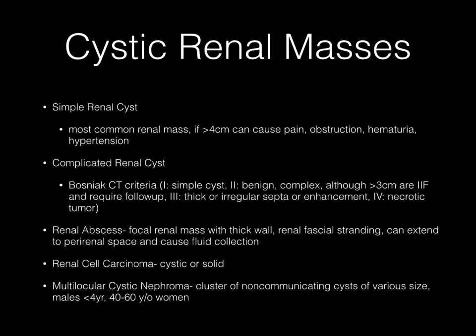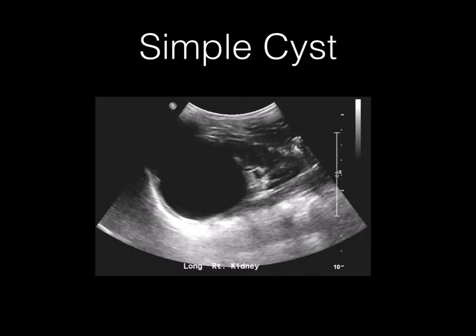Renal abscesses present as focal renal masses with a thick wall and renal fascial stranding, and can extend to the perirenal space. Renal cell carcinomas can be cystic or solid. The final lesion is multilocular cystic nephroma — a cluster of non-communicating cysts of various sizes — with bimodal age distribution, usually in males less than four years old and in women between 40 and 60 years. Here is a simple renal cyst: it is anechoic, has a well-defined posterior wall, and shows posterior acoustic enhancement.